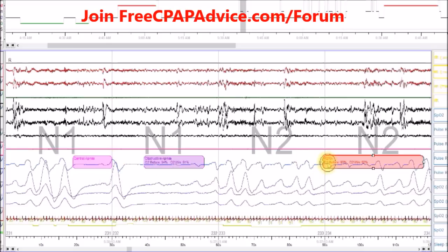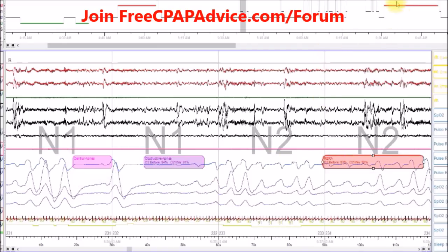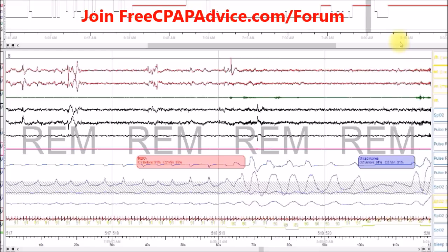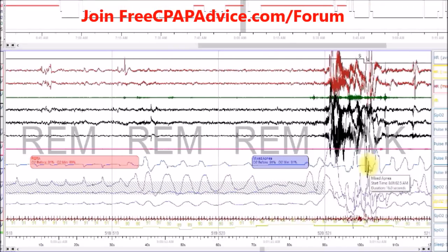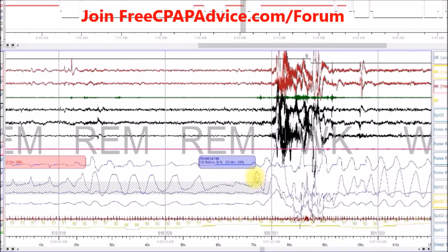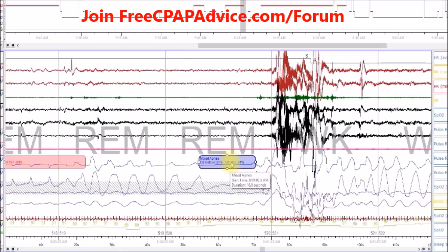Central apnea is treated differently than obstructive apneas, so if you have both, that is what makes it complex. Now here we are in REM sleep and you can see there's a respiratory effort related arousal, and then we have a mixed apnea. Some people think that by having mixed apneas, that is complex sleep apnea — that's not true. Mixed apnea is simply a type of apnea where half of it is central, where the person's not trying to breathe, and then all of a sudden they do try to breathe. All you have to do is have one chest or abdominal increase or change with a flat line, and that's a mixed apnea. That's not indicative of complex sleep apnea, but in this case the person was diagnosed with complex sleep apnea — just wanted to clear that up.